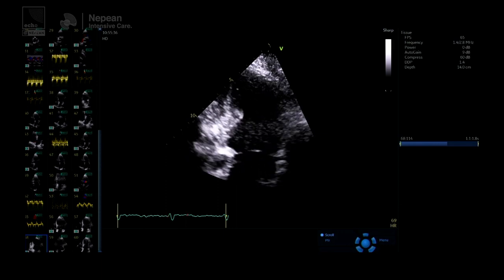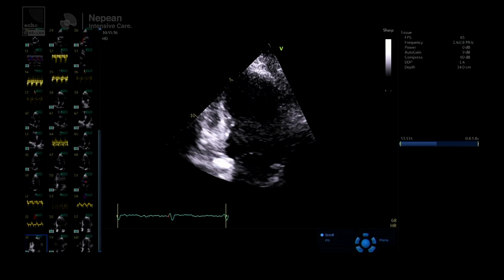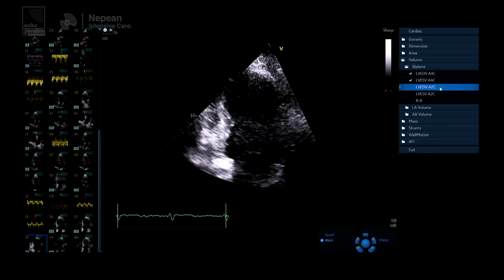That's one of the reasons it's not perfect. The machine gives you a volume from the apical four chamber. Then you want an orthogonal plane to the apical four, which is your apical two. Louise will trace the volumes in diastole and systole, and the machine puts that together to give you a biplane volume — Simpson's biplane.